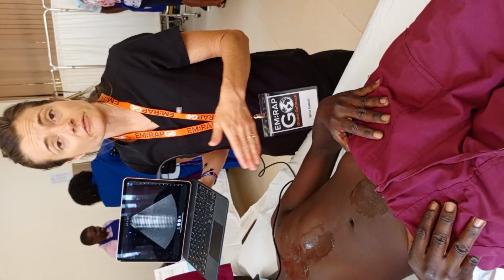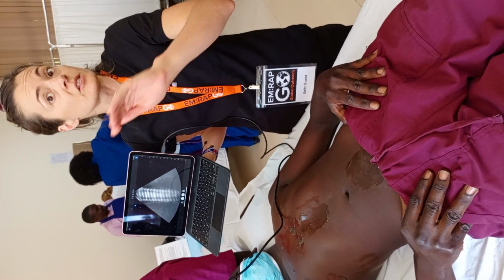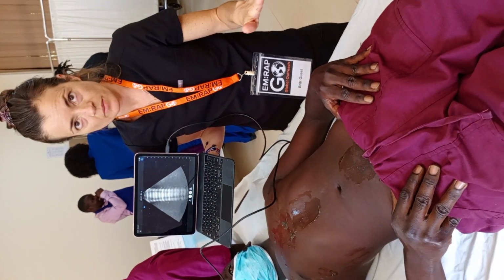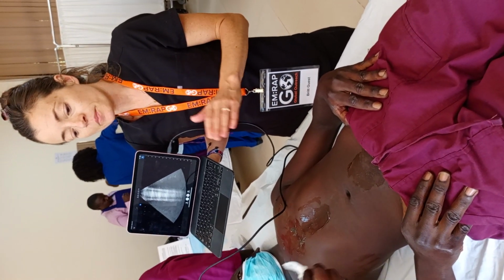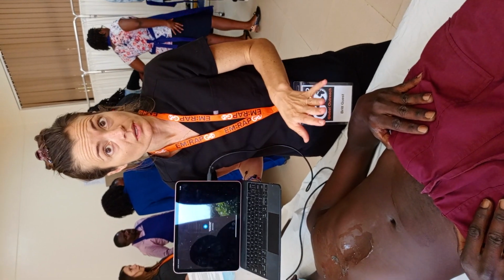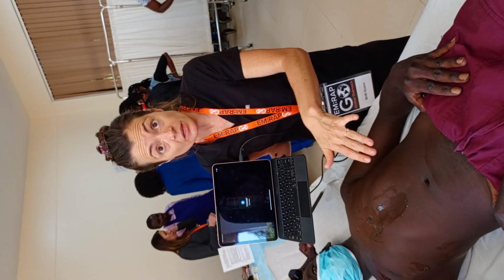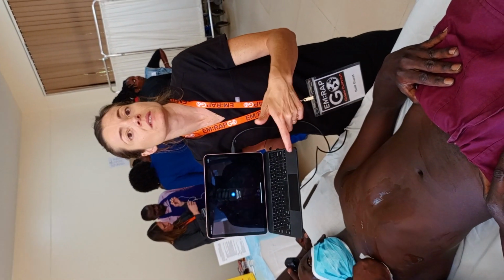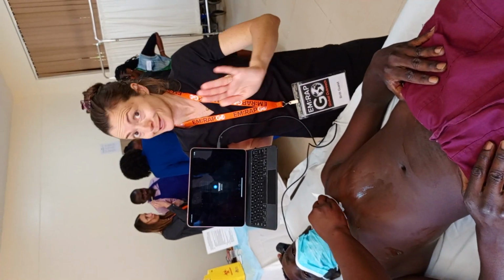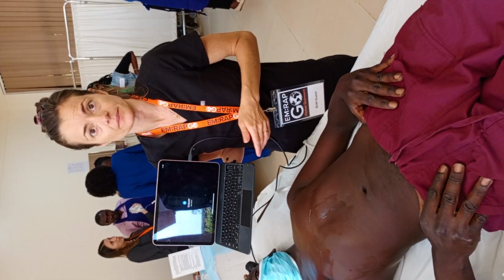I should clarify that to get a positive FAST takes a good amount of blood. So if you see a positive FAST, the person has free fluid. In a trauma, it's blood until proven otherwise. But if the person has a very tender abdominal exam and you had a negative FAST, that does not rule out bleeding. It says there's not enough blood for me to visually see it right now, but there still can be internal bleeding. I'm just not able to see it on the ultrasound. So a positive FAST is yes, there's fluid, we see it. But a negative FAST doesn't totally rule out internal bleeding.